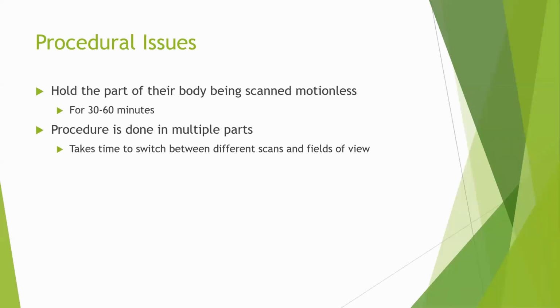Even individuals like adolescents who have CP or any other childbirth defects, congenital genetic defects, where they have to move involuntarily, are also not suitable candidates for MRI. It's not that there is any contraindication, it's because they cannot lay motionless on the gantry, the platform where the patient needs to lay down.